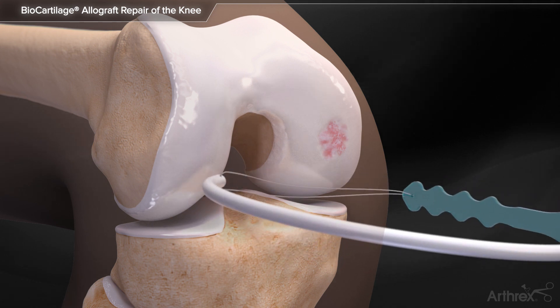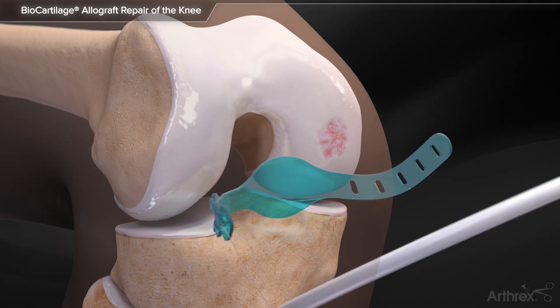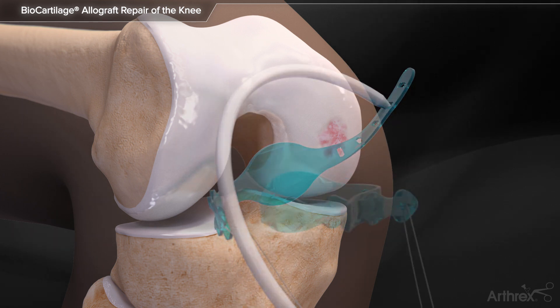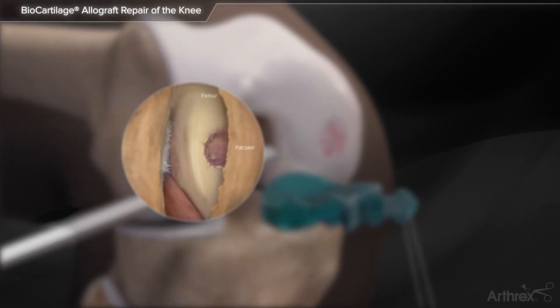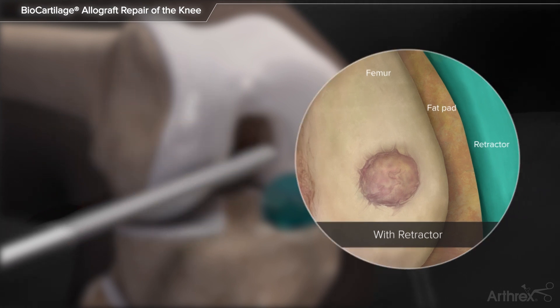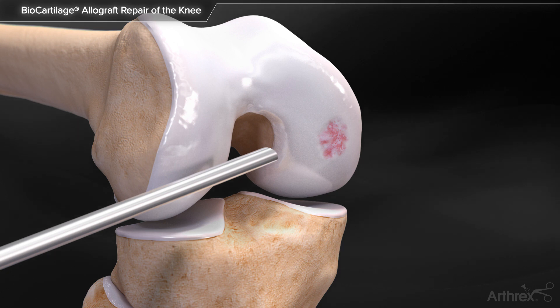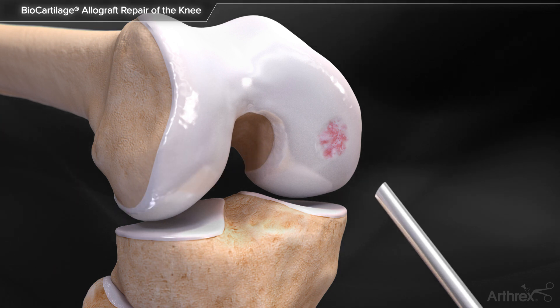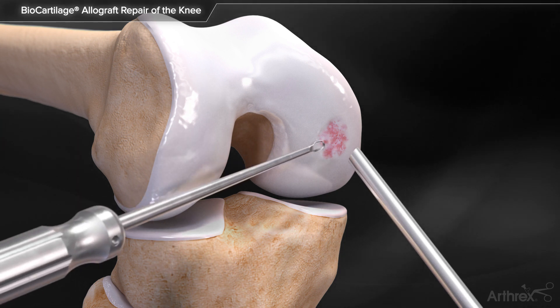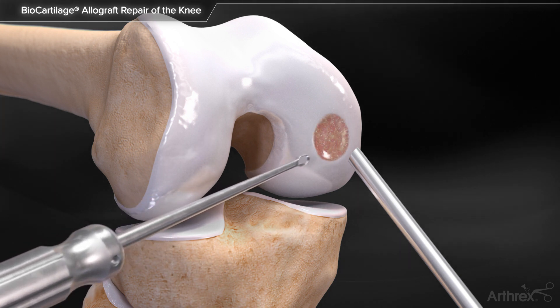To prepare for implantation, utilize the tissue retractor to improve visualization of the joint. Then debride the defect, remove the cartilage layer, and establish stable perpendicular margins.